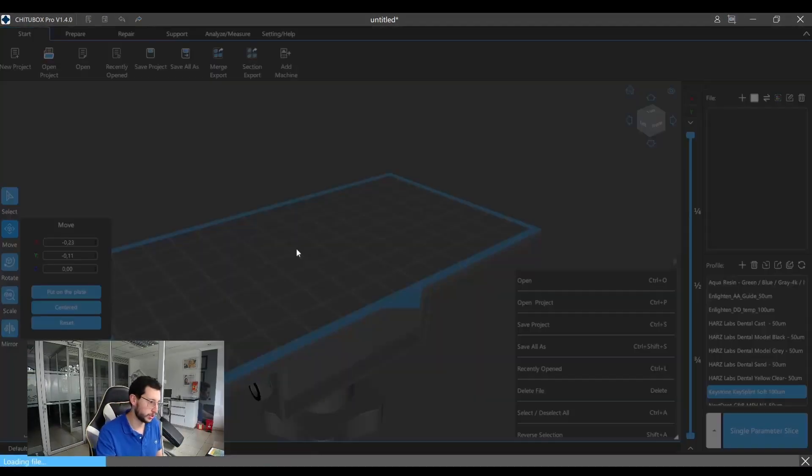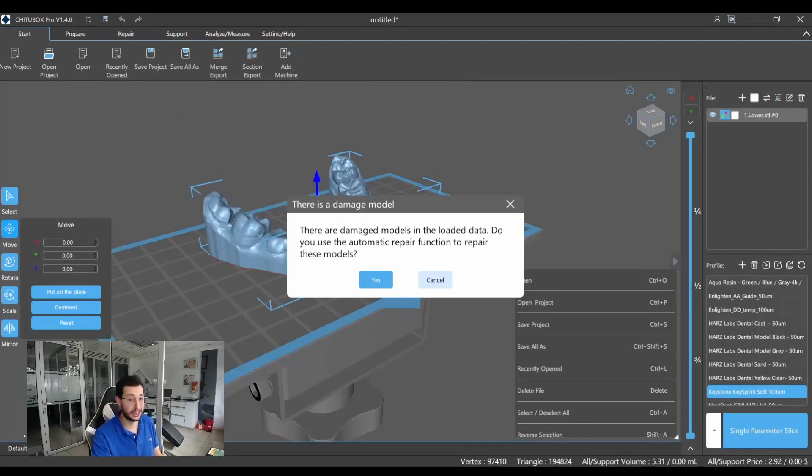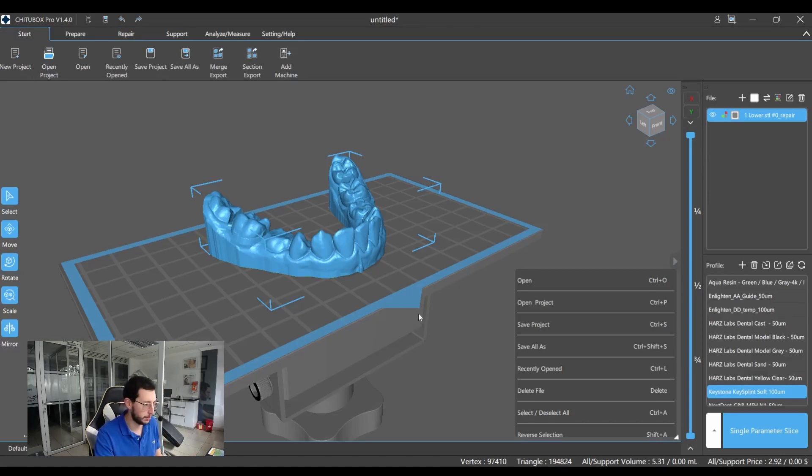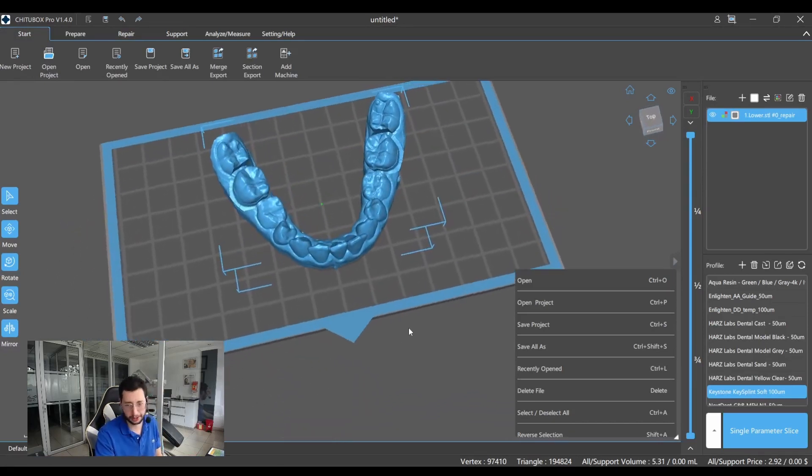So we drag and drop our model here in ChitoBox Pro, and as you can see the first difference is that we have automatic repair. So if I click here, it will fix any problems this mesh may have, which will prevent some problems later on.